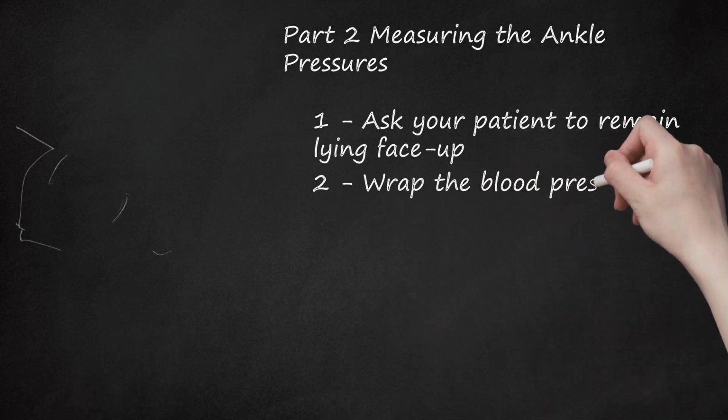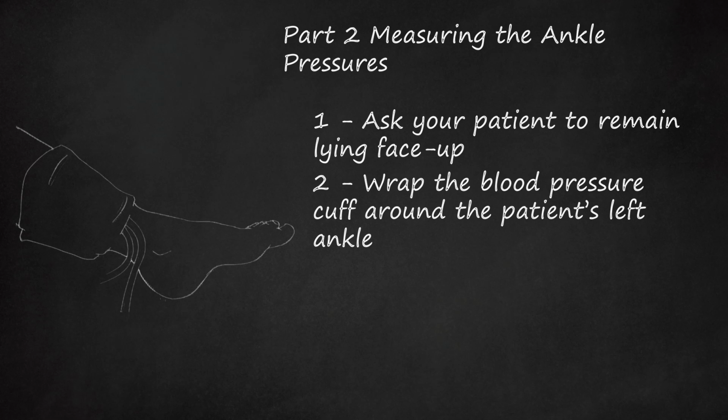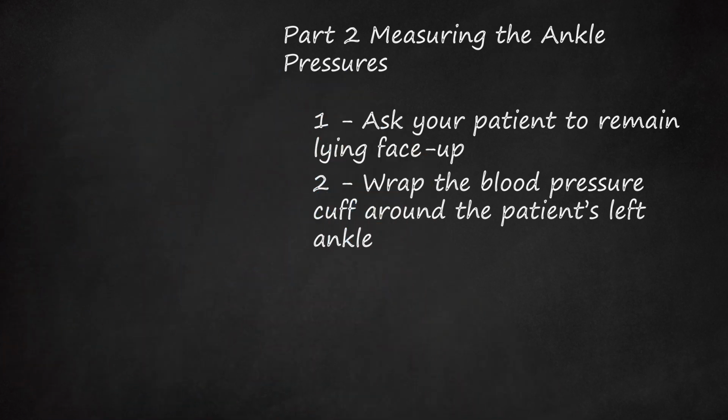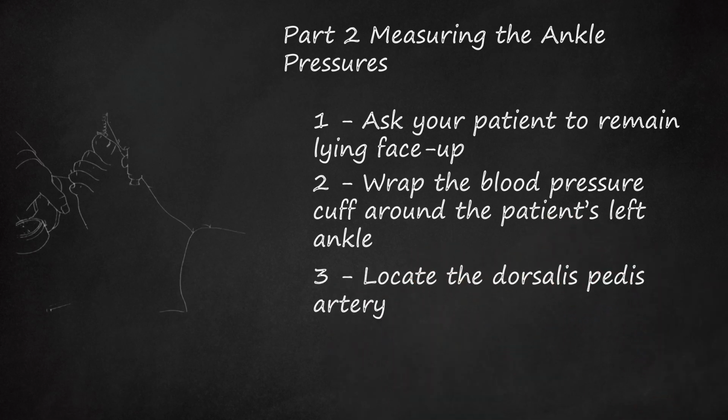2. Wrap the blood pressure cuff around the patient's left ankle. Position the cuff 2 inches above the malleolus, the bony knob, of the ankle. Make sure that the cuff is not wrapped too tightly. Check its tightness by inserting 2 fingers. If you can't insert 2 fingers, then it is too tight. Make sure that you have the right-sized cuff for your patient. The width of the cuff should be slightly wider than the diameter of the lower leg. 3. Locate the dorsalis pedis artery.